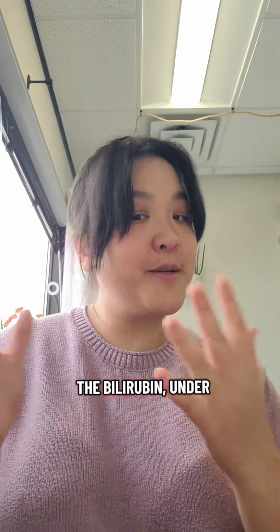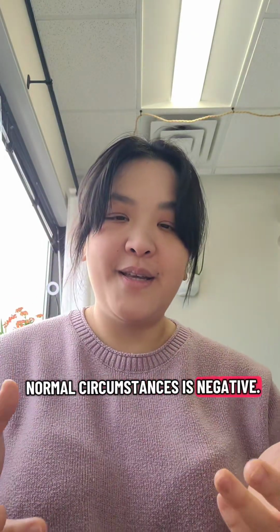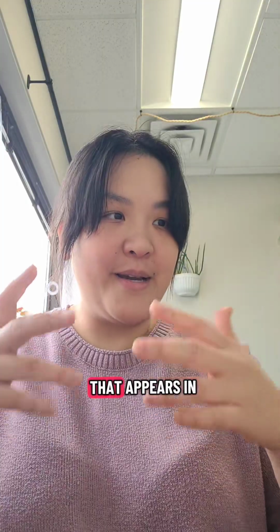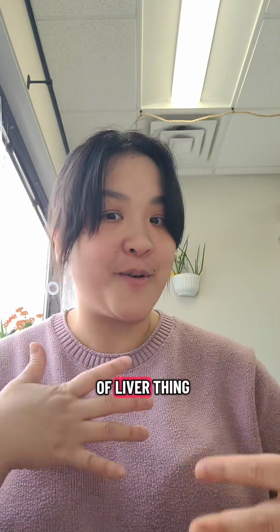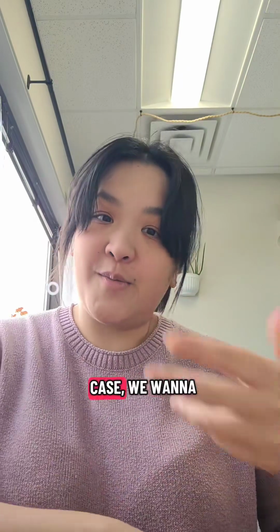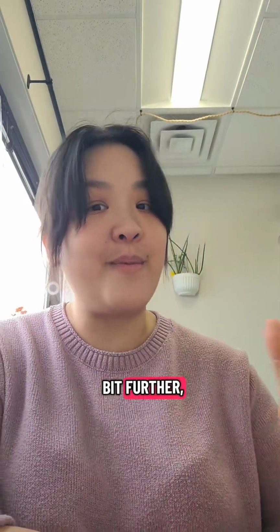The bilirubin, under normal circumstances, is negative. The conjugated bilirubin that appears in the urine is usually indicative of some sort of liver problem going on. And in that case, we want to look into that a little bit further, maybe with some blood work.